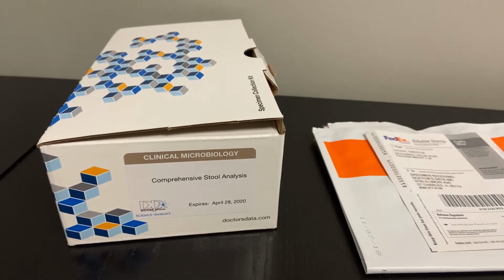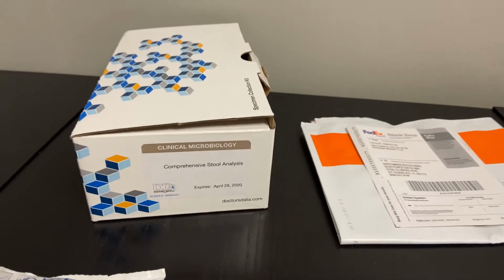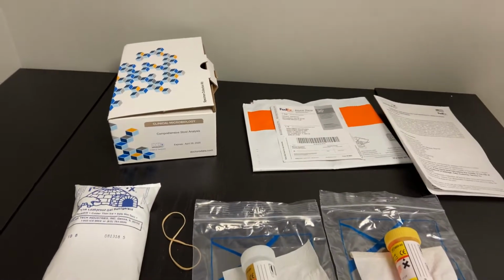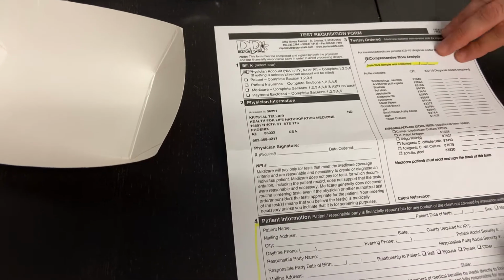Your doctor has ordered the Doctor's Data Comprehensive Stool Analysis. You'll see the contents of the kit outlined here on the table. What we will first start to address is the test requisition form. You'll see a couple different boxes here, paying special attention to the highlighted areas.